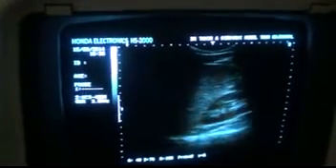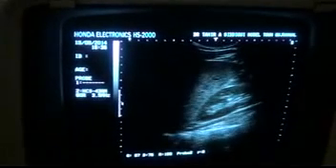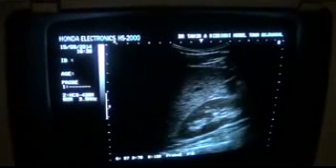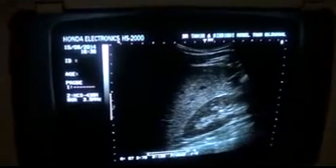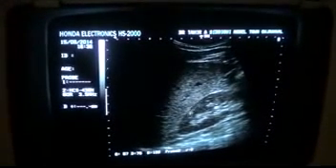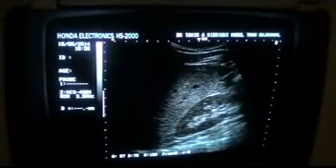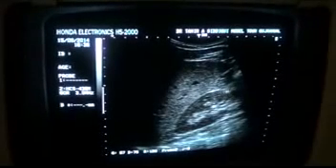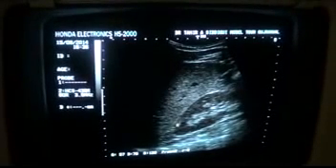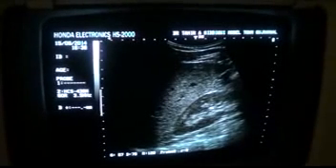This video segment is prepared for beginners, to tell you the definition of a normal renal parenchyma. This is the right kidney, and here you are seeing the upper pole, mid region, lower pole. This is the capsule, and below the capsule, the area you are seeing is the cortex.